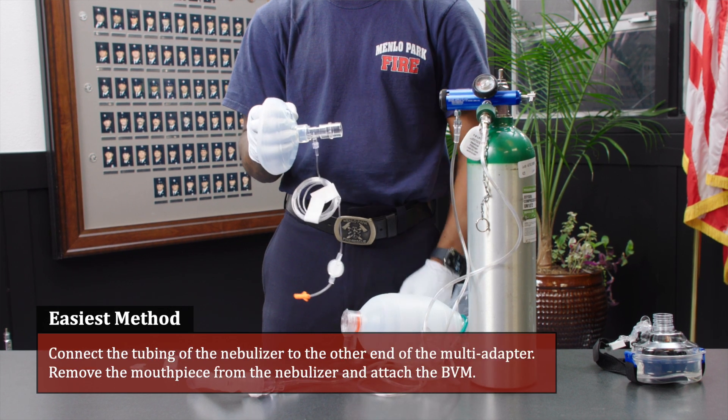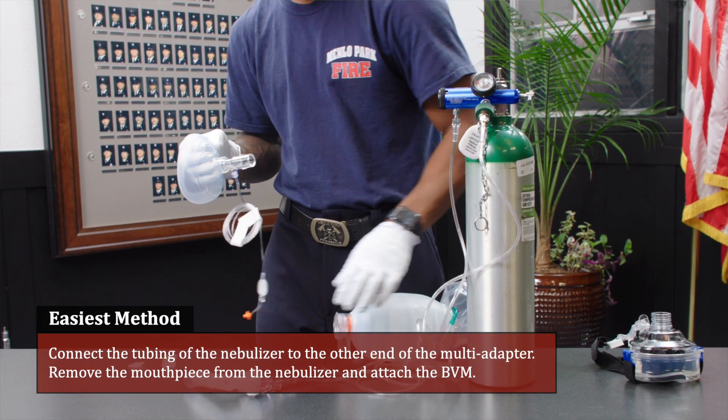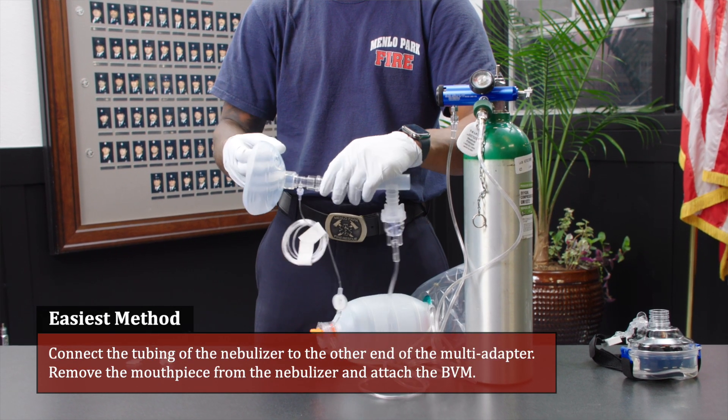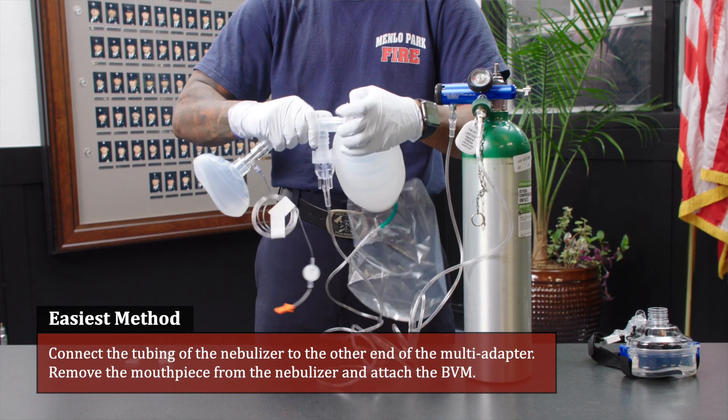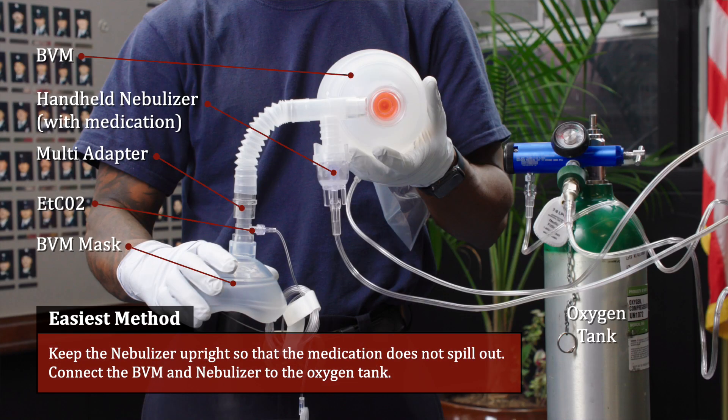Connect the tubing of the nebulizer to the other end of the multi adapter. Remove the mouthpiece from the nebulizer and attach the BVM. Keep the nebulizer upright so that the medication does not spill out. Connect the BVM and nebulizer to the oxygen tank.